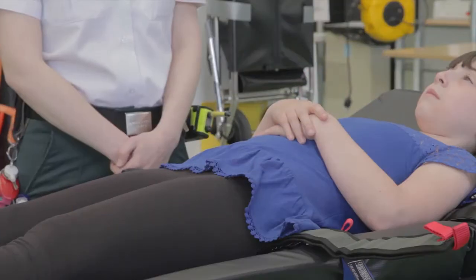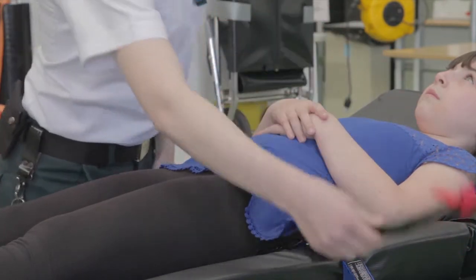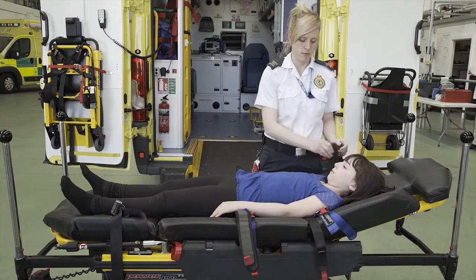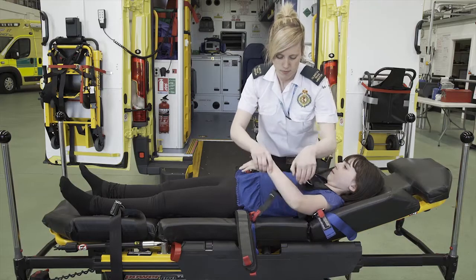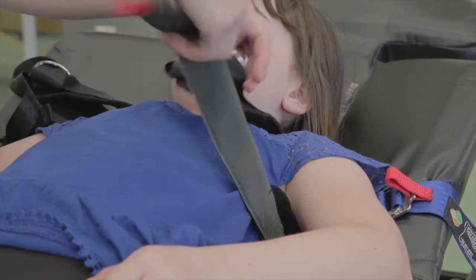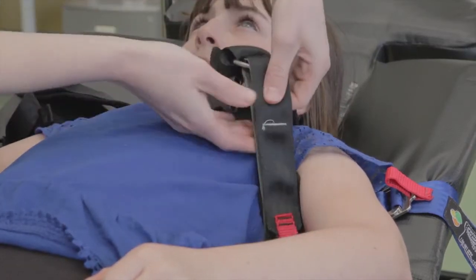When positioning the child on the stretcher, ensure that the child's waist is level with the waistband. Now bring the shoulder straps over the child's shoulders. Feed the red tab on the arm strap through the D-ring and secure the hook and loop against the strap below.